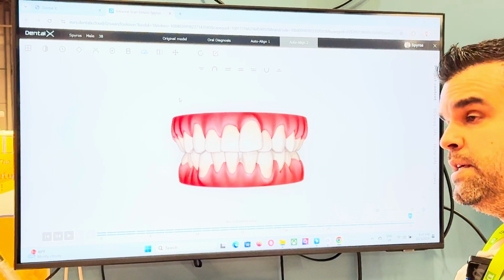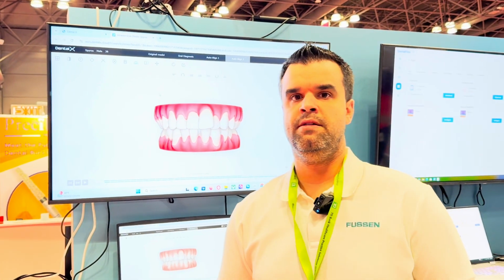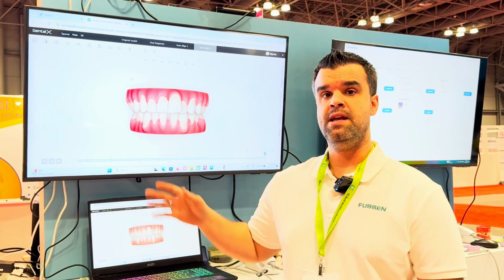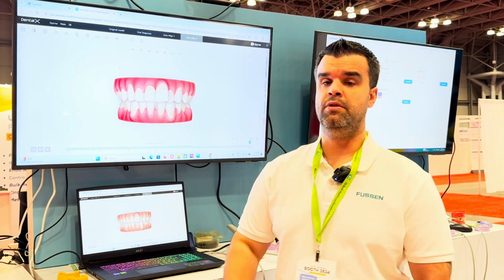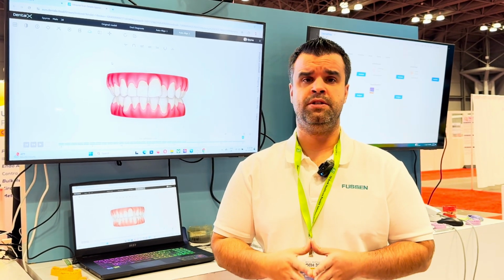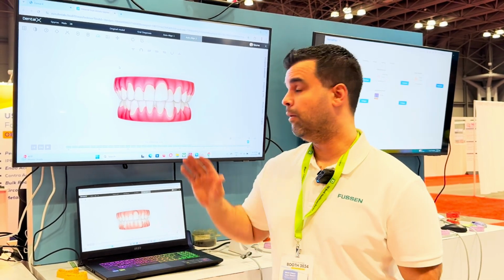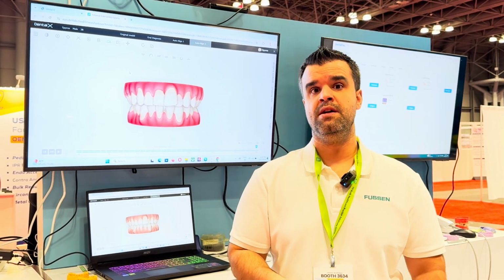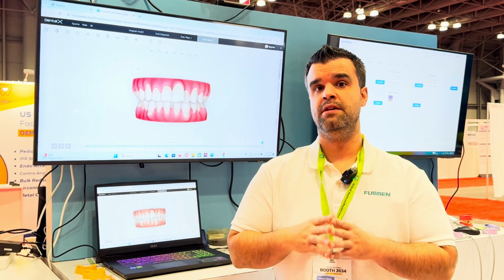And so here was the system that you will use every day by just using our scanner without having any special knowledge. By using the AI, you set very small and very simple parameters, and the system will do everything by itself. So our scanner gives you new potentials by using AI for free. I mentioned that: for free. All these tools that you will receive from us will be for free, including with the software of the scanner, and you will be able to extend your practice capabilities and potentials using our system.